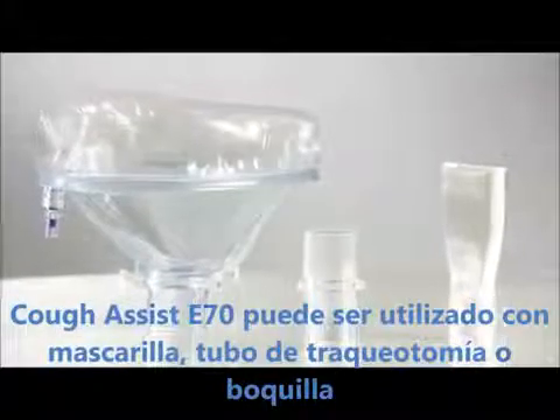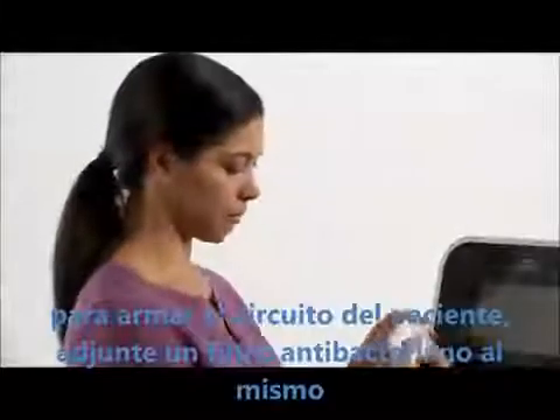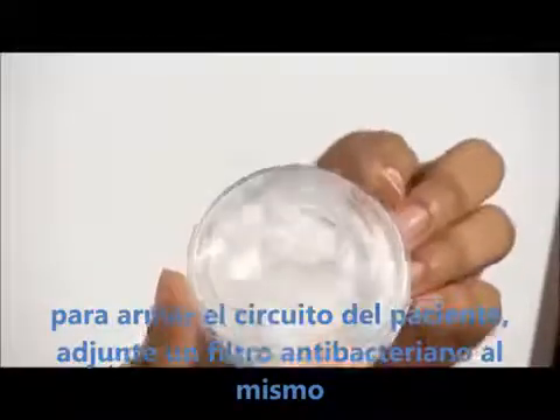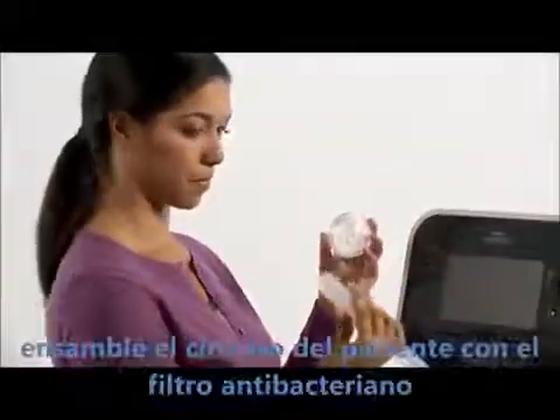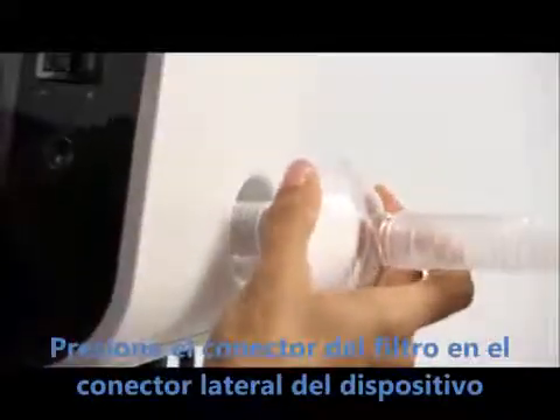CoughAssist E70 can be used with a mask, tracheostomy tube, or mouthpiece. To build the patient breathing circuit, attach a bacteria filter to the breathing circuit connection. Attach the circuit tubing to the bacteria filter, then press the filter onto the connector on the side of the device.